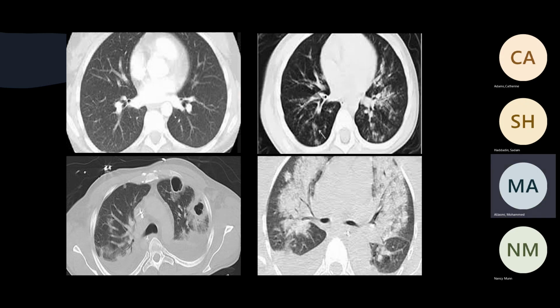So the thing is, if I'm giving volume, all of us, if I ask you, what's the RDS, how much should you get? 4 to 6 ml per kg ideal body weight, is that right? So why do we have this thought? Why did we think we should go down from 12 to 6 or 12 to 4? It's the conception of baby lung. So the normal lung in this patient is less than in this patient, less than in this patient, less than in this patient.